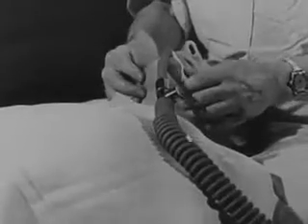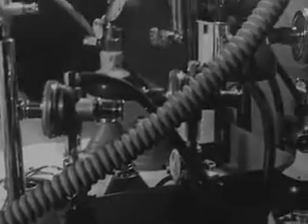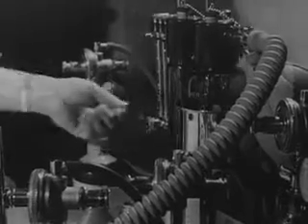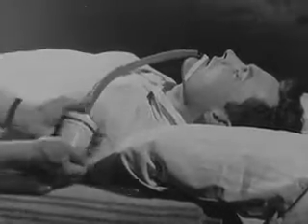With the tube in, anesthesia can now be maintained by ordinary inhalation methods. Often the anaesthetist has to control the administration from a distance. Any efficient machine will do, and the system may be open or closed. When no machine is available, Flagg's method of attaching a length of rubber tubing to an ether can is a useful improvisation in emergencies.